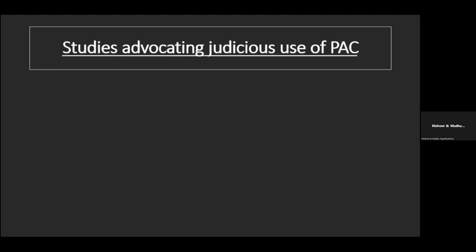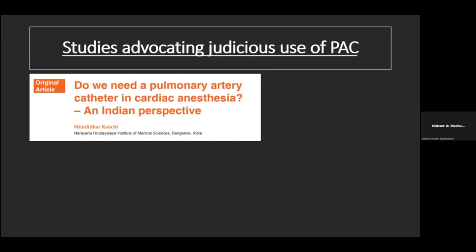An Indian questionnaire-based study conducted by Dr. Muralidhar Kanchi involved over 100 cardiac anesthesiologists across the country, conducting over 500 cases in 1 year. They observed that 83% of the cardiac anesthesiologists used pulmonary artery catheter in certain subset of patients without increase in the mortality attributed to the pulmonary artery catheter.